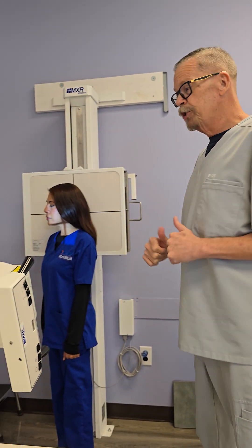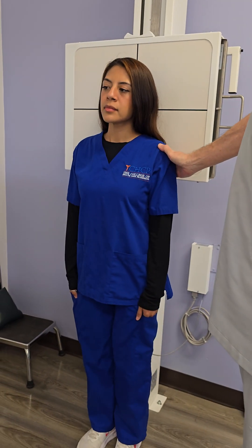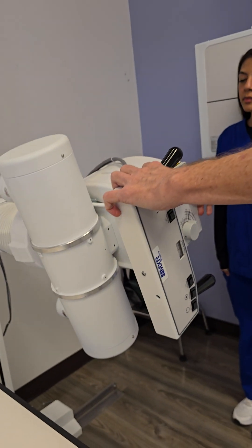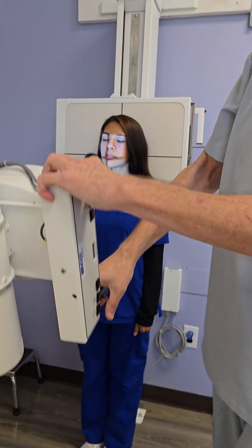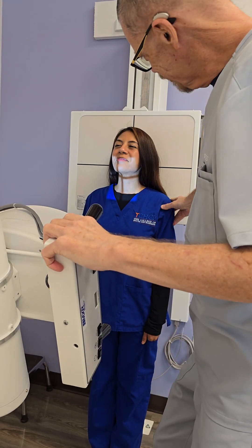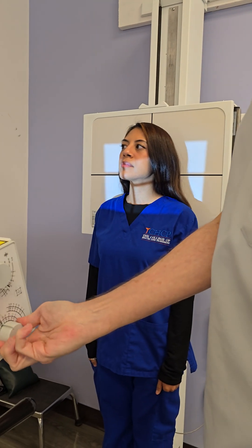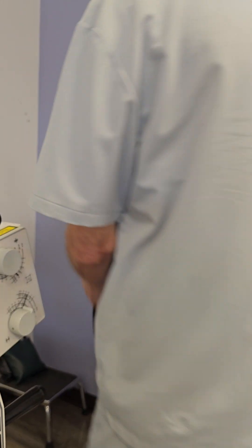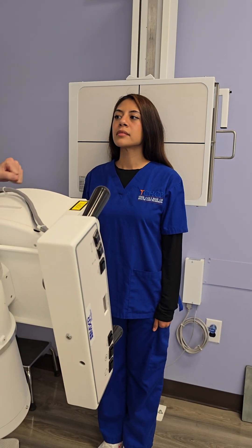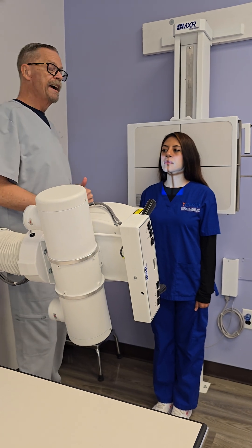We've done our lateral and both obliques. Next we're going to do our AP axial. Go ahead and put your back against the board, facing out. This one we do want at 40-inch SID, and we still want a 15 to 20 degree cephalic angle, still centered at C4. Go ahead and raise your chin up. Check our alignment again. Nice tight collimation so we don't have any extra scatter. The right marker is on her right side. Be sure your central ray is down that mid-sagittal plane. Have the patient hold very still — no movement, no breathing. Exposure is made. That is your AP axial of the cervical spine.